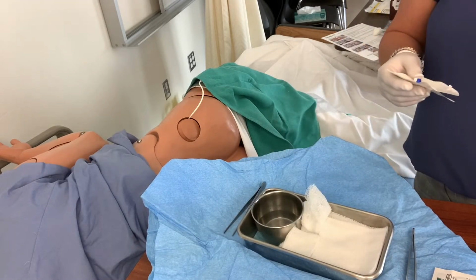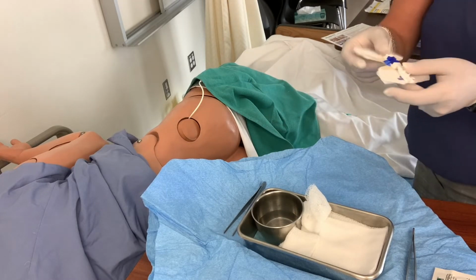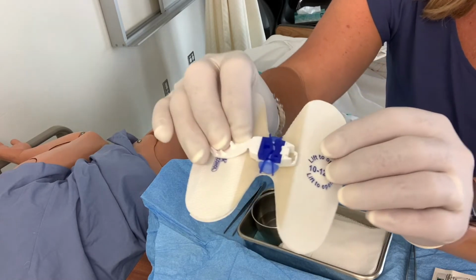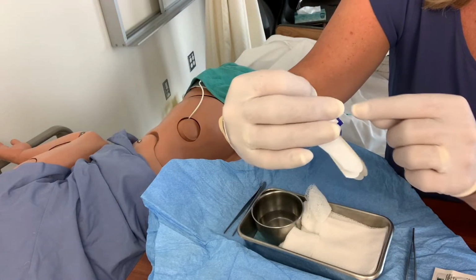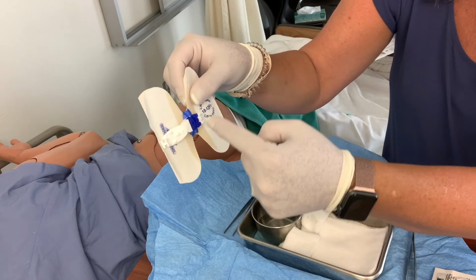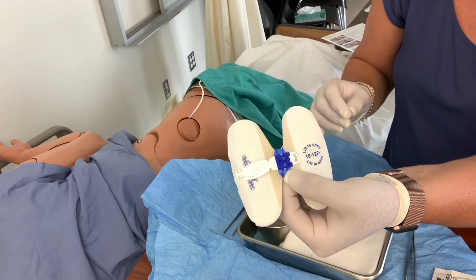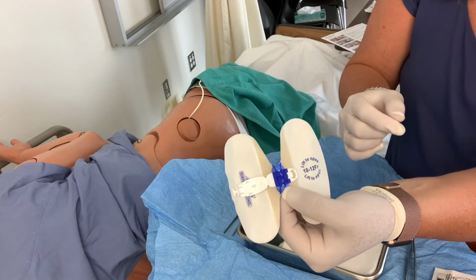So at this point I am going to take my StatLock device and try to line it up. If I get it in close enough, I hope you can see. The channel that it fits into is hard to see, but it's not straight. The tube comes down, then there's a bit of a curve, and then it goes back down. But you essentially want to follow the catheter right into the path, and it's going to take some pushing to get it to actually sit into the dark blue part in the center.